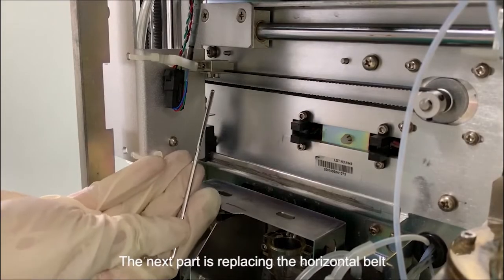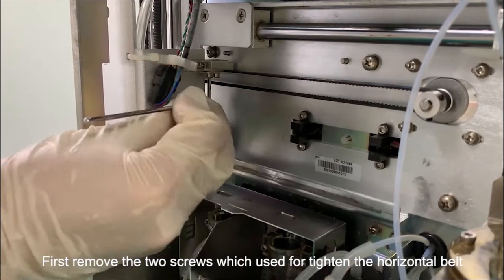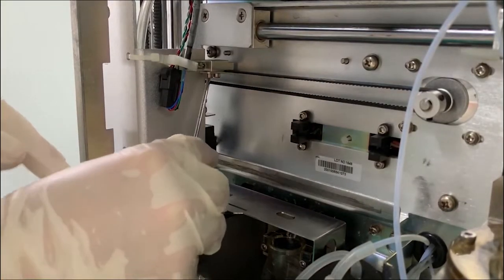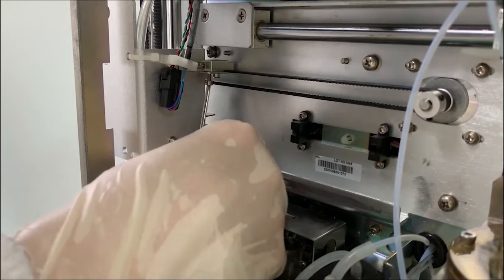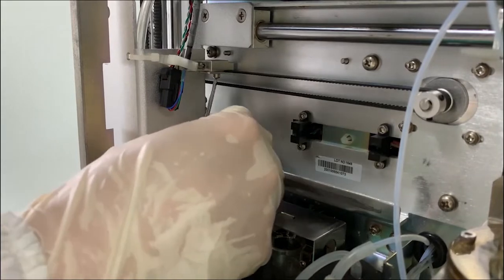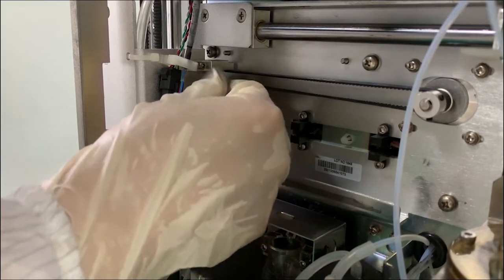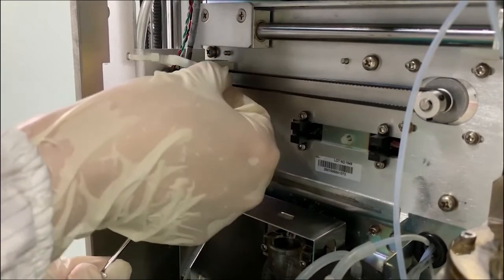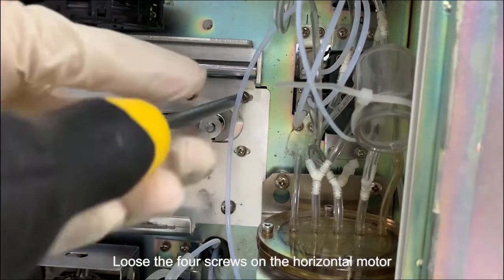The next part is replacing the horizontal belt. First, remove the 2 screws which are used to tighten the horizontal belt. Loosen the 4 screws on the horizontal motor.